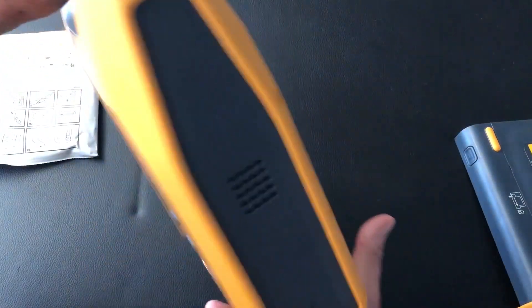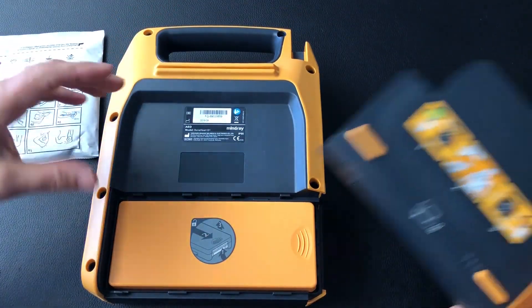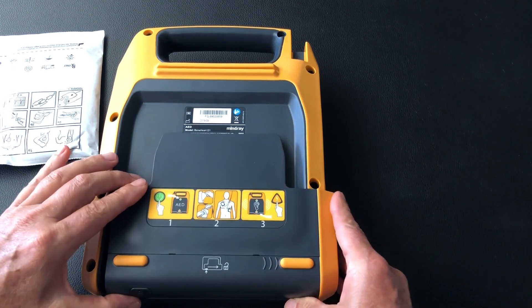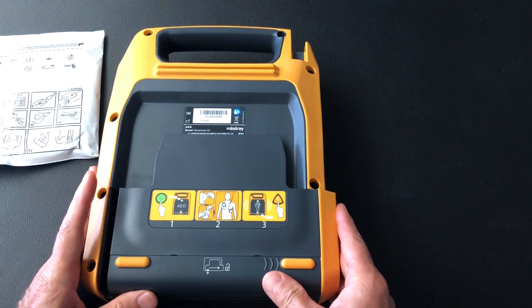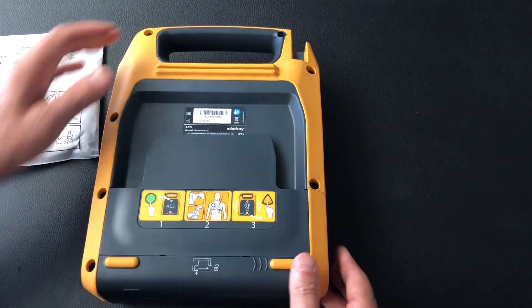So now we turn it over and put the battery cover back on, just the reverse of how we took it off. Push the little button in and then push it across to the left, just like that.